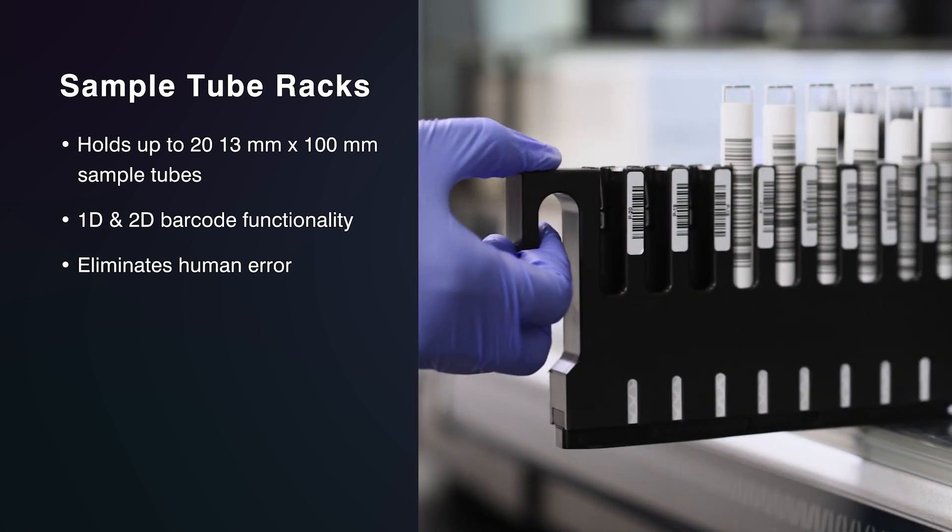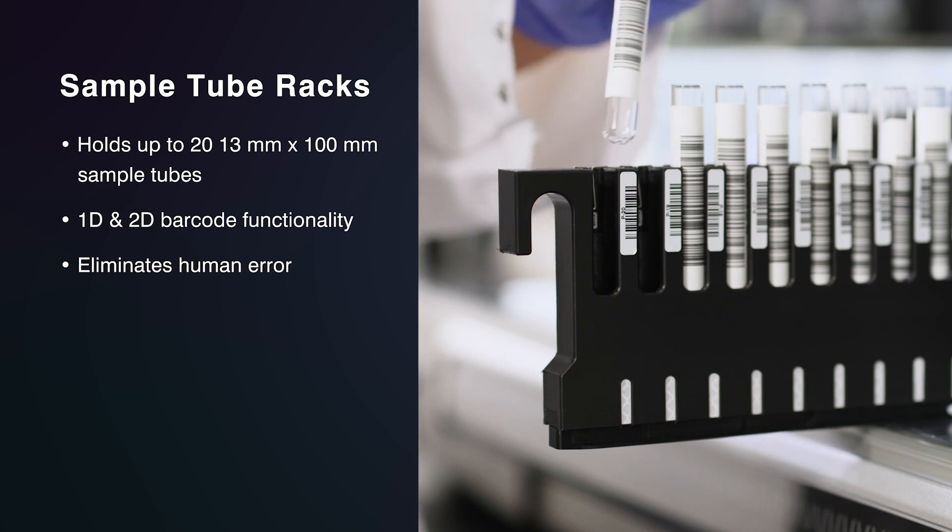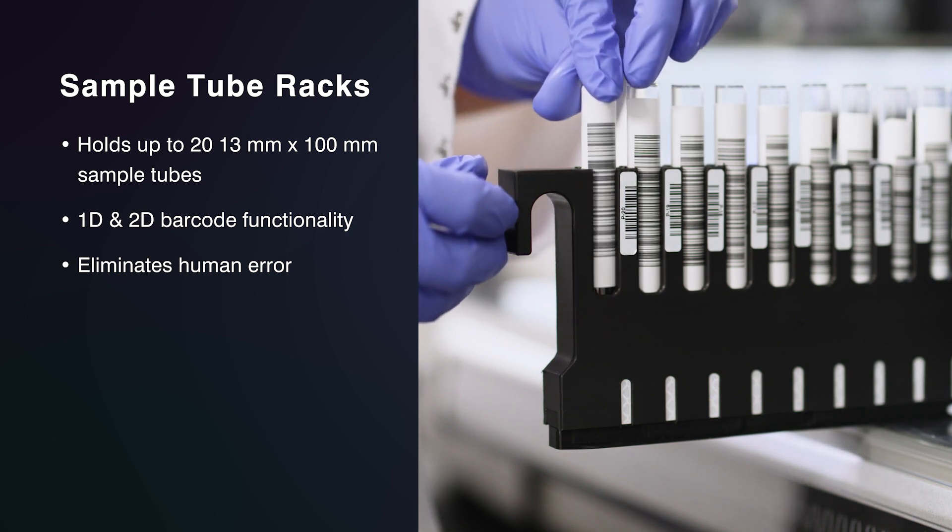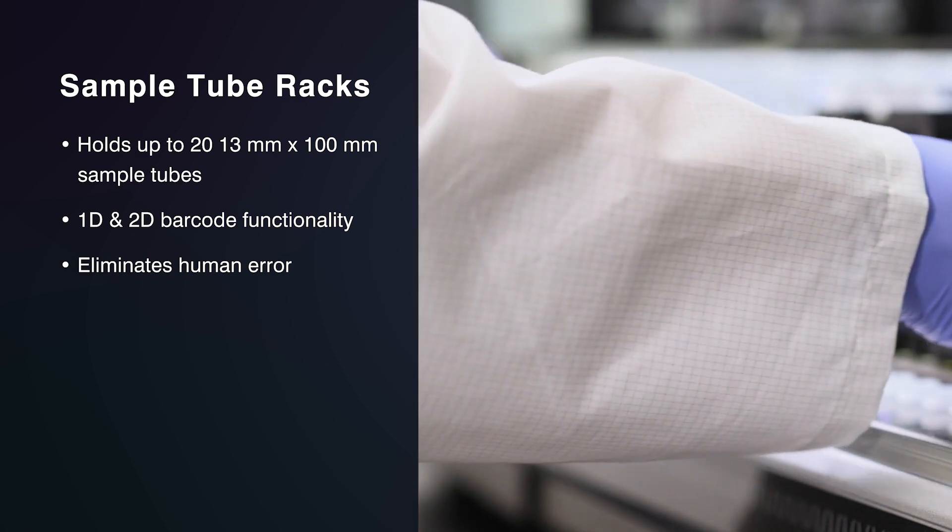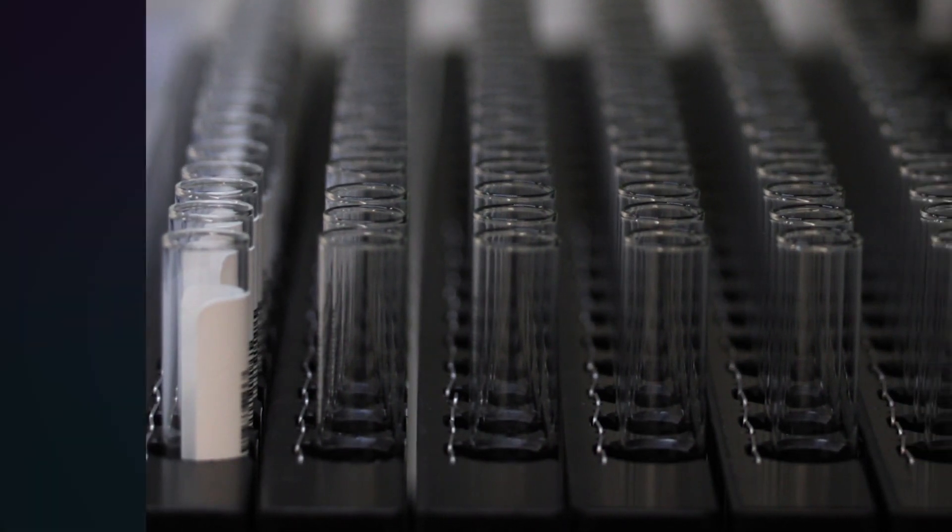Sample tubes are loaded into the racks and then scanned for barcodes upon loading onto the deck. Each sample rack can hold up to 20 sample tubes. Both 1D and 2D barcodes can be utilized for optimizing sample management. This eliminates human error associated with the manual entry of data.